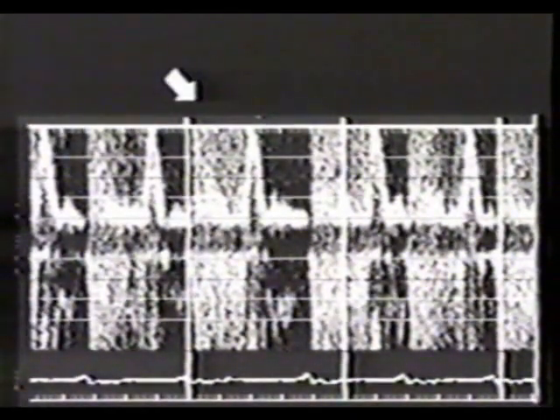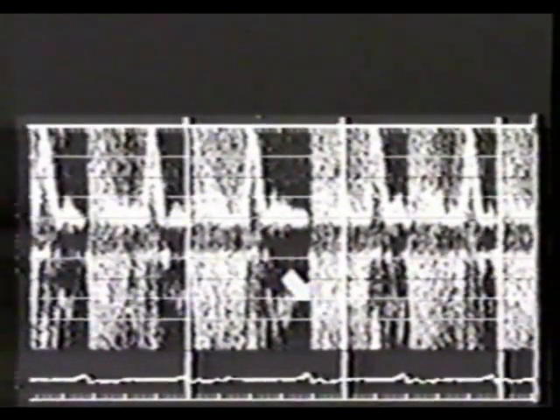This is the corresponding Doppler spectral display. The ECG is below. Note this systolic signal. Since we are only analyzing flow within the sample volume, and since the sample volume is in the left atrium, this signal must represent mitral regurgitation.